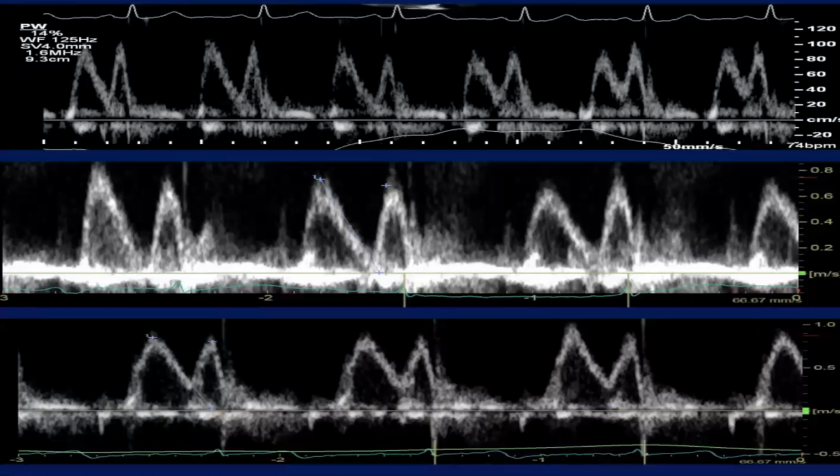And if you give the inflow time to speak, it will tell you something. Those patients, if you see here, for example, let's take this one. So E is more than A. Then E and A are a bit equal. Then E is less than A. Those patients are having some element of diastolic dysfunction just by observing the inflow and its change during respiration. It's exactly as if you're telling the patient to do Valsalva, and you're decreasing the flow through the mitral valve, and you can see some changes.